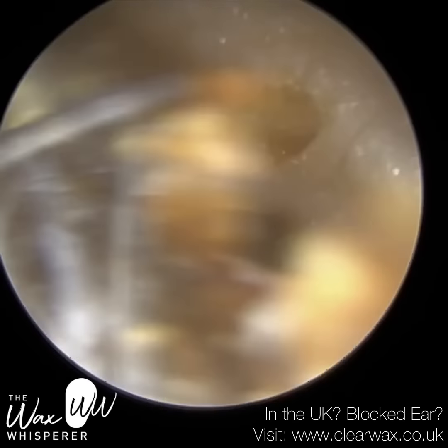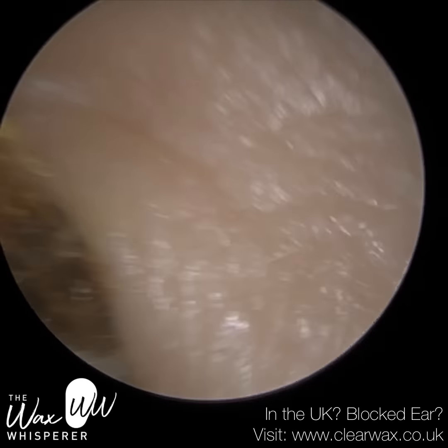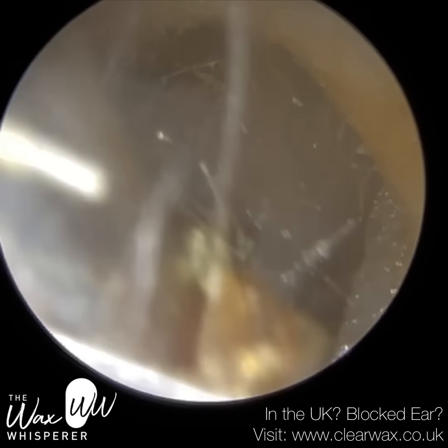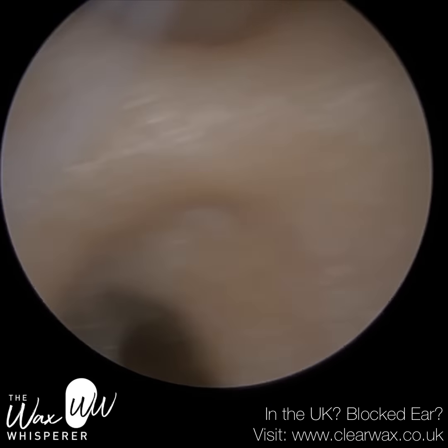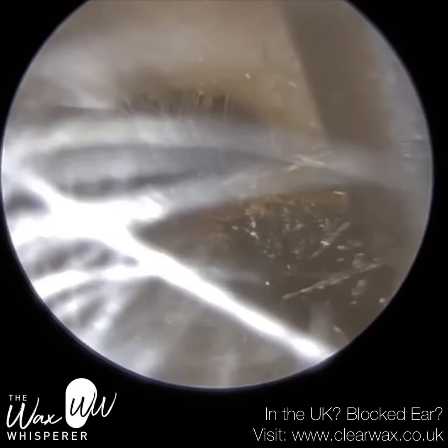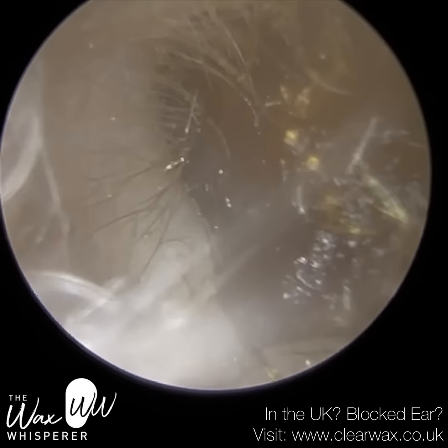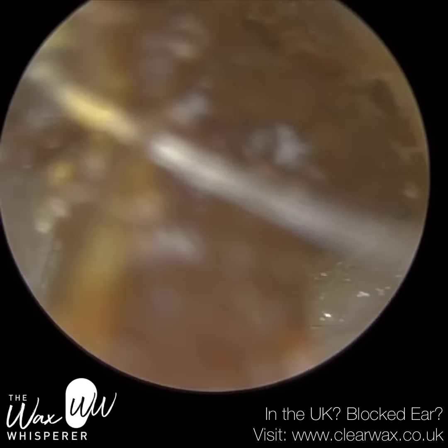They're actually due to fly tomorrow, so they wanted to get the ears examined and any wax removed prior to flying. You can see it's coming out, it's quite sticky. That's another characteristic of dead skin. As it dies and macerates, it becomes wet and sticky and stretchy, almost like caramel. Again, it's coming out in a long stretch. It's resistant to using a curette, for example, because of the soft nature of this dead skin plug. As you use a curette, you could just squash it and spread it against the canal wall, which makes it a bit untidy. So just persevere with suction, as we can almost suction it away from the ear canal and try and get it in large pieces.